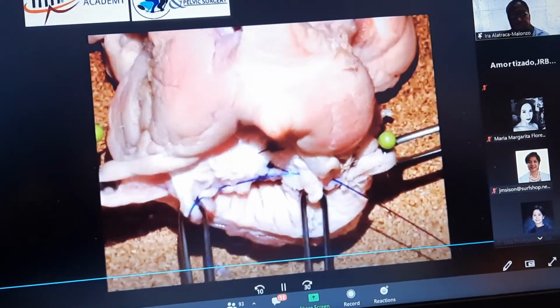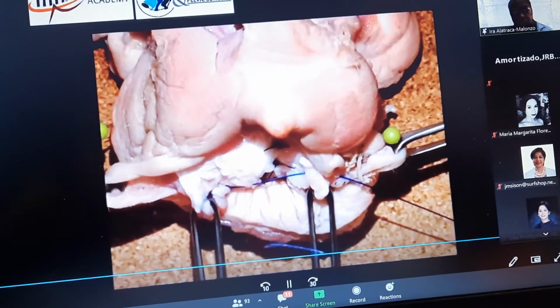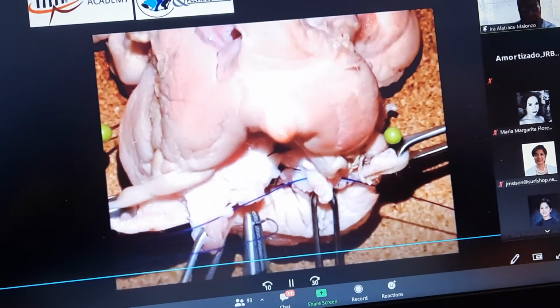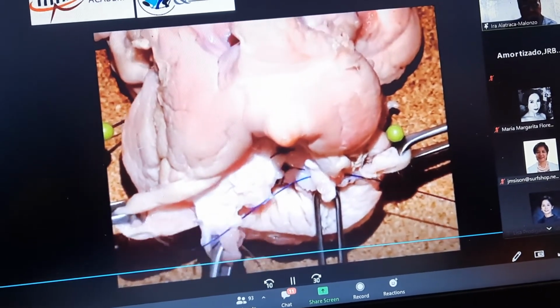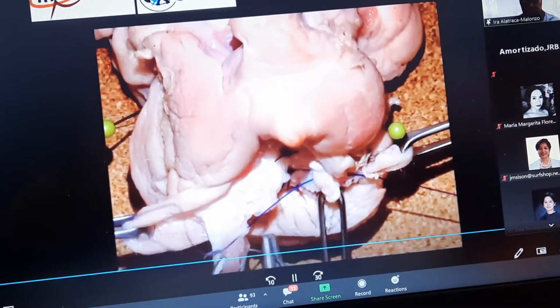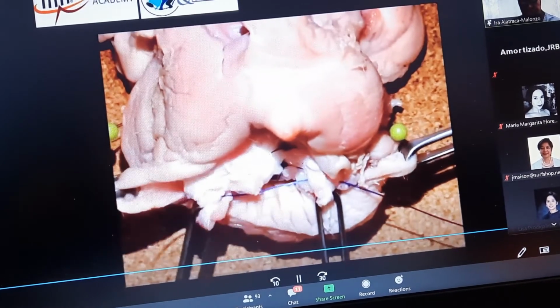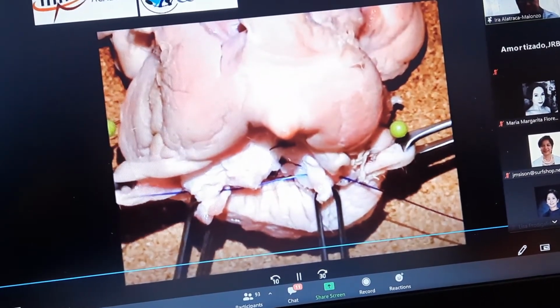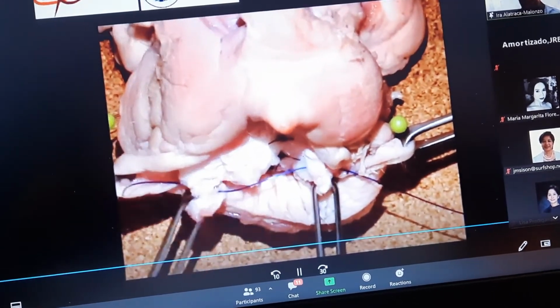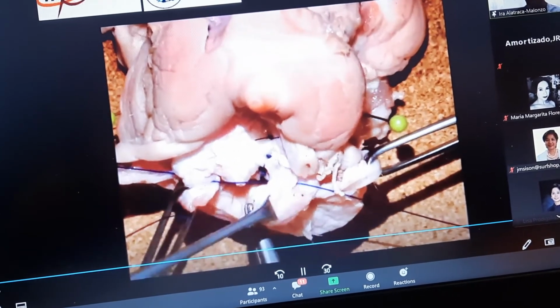And then you turn your needle around so that you're able to enter this time just adjacent to that exit point there, also on the medial end of the right, bottom to top this time, and then cross to the patient's left end on the more lateral side, just beside your first entry.